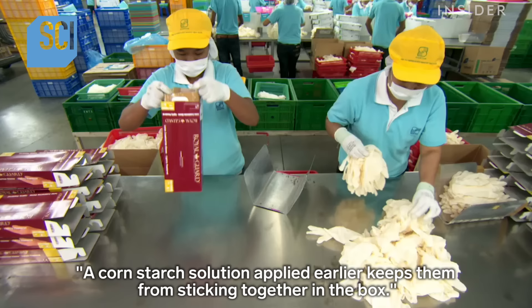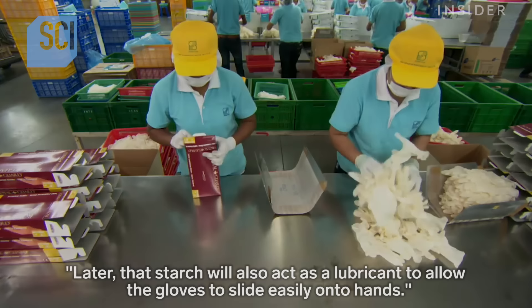They pack the gloves in batches of 100. A cornstarch solution applied earlier keeps them from sticking together in the box. Later, that starch will also act as a lubricant to allow the gloves to slide easily onto hands.